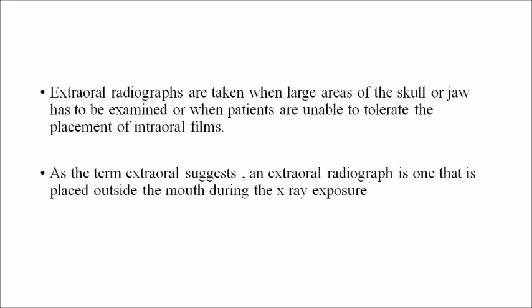As the term extraoral suggests, an extraoral radiograph is one that is placed outside the mouth during the x-ray exposure. The term extraoral means the radiograph is placed outside the oral cavity during the x-ray exposure.